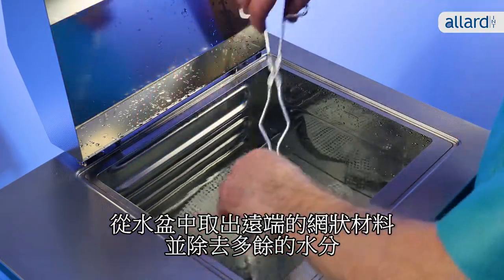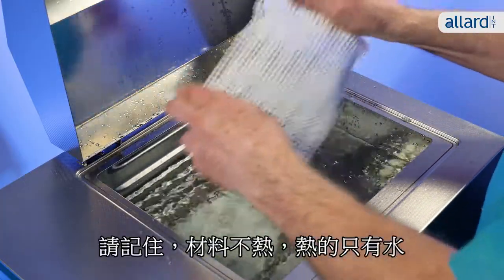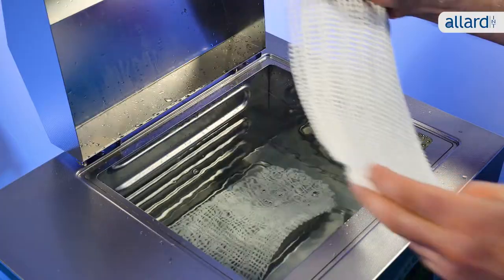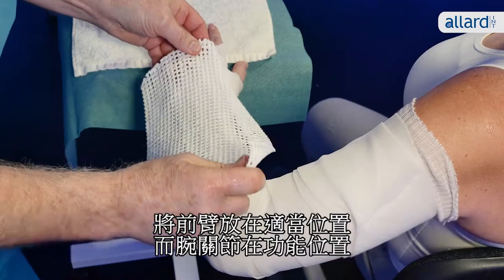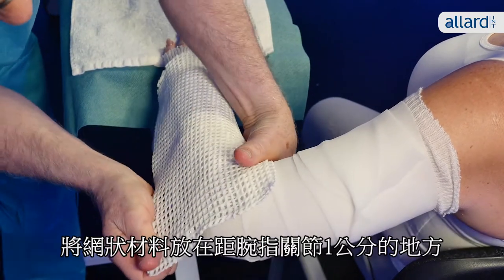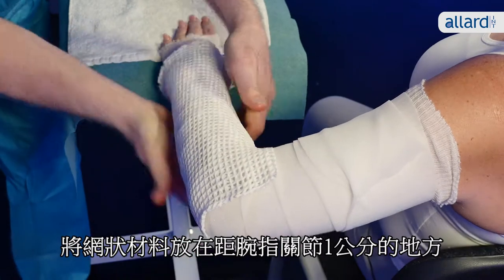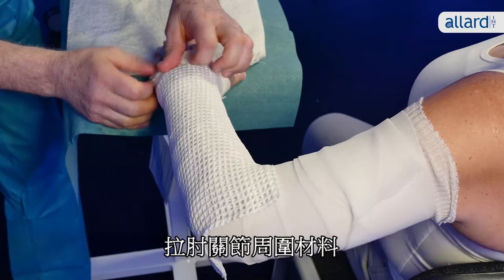Take the distal part of the splint from the water bath and remove excess water. Remember it isn't the material that's hot, only the water. Place the patient's arm with the elbow at 90 degrees, the forearm in neutral position and wrist in functional position. Place the splint one centimeter proximally from the MCPs, pulling the material around the elbow.